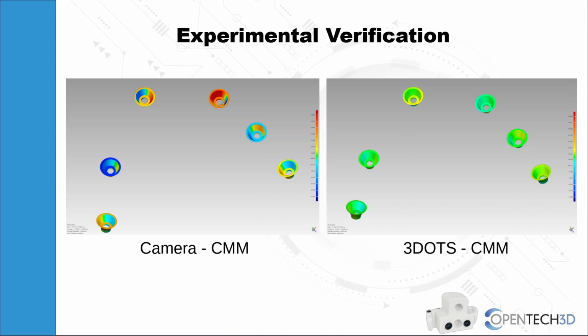We well know that what is rigid on the model in the mouth is a tissue, and tissue is deformable. Then in the mouth we have blood and saliva. On the model instead we have neither blood nor saliva. So the situation we have in the mouth is worse, way worse than the one we have on the model. If we would be able to do the same test in the mouth, we would expect the image on the left to be much redder and much bluer.